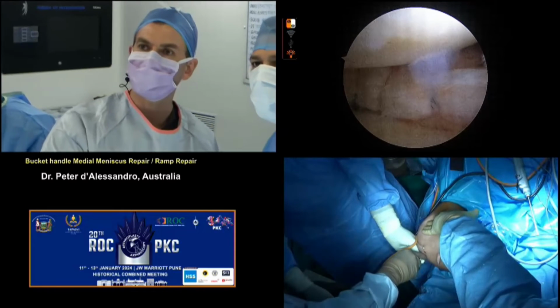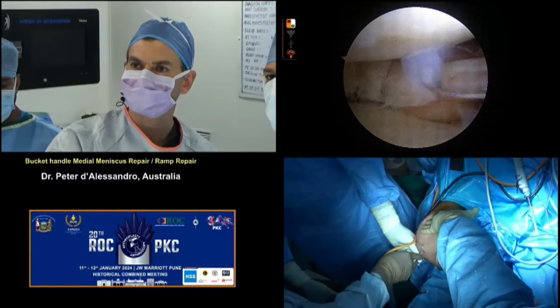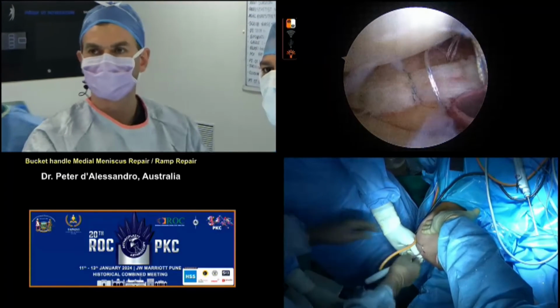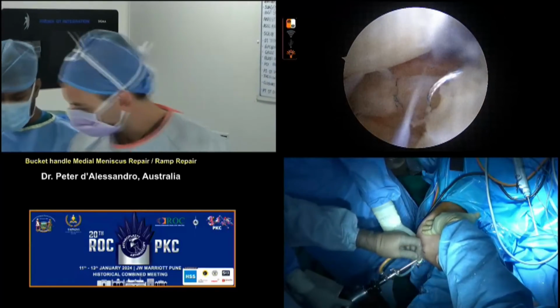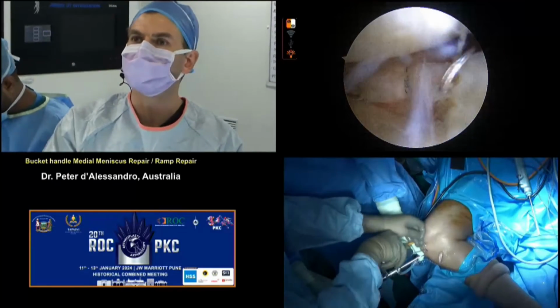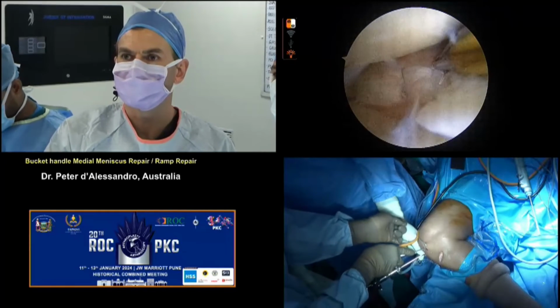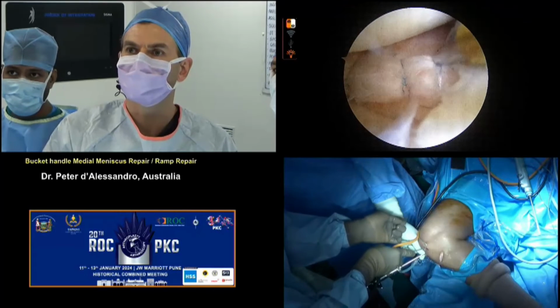But at the very back, inside out, I think is great, but it starts to get a little more scary. You can see I've gone to reverse curved here for my angle of the dangle, as we say. And then obviously as we come round to the front, we'll use outside in using needles, or for those of you who've seen the AcuPass Direct, that's also a great device to use.